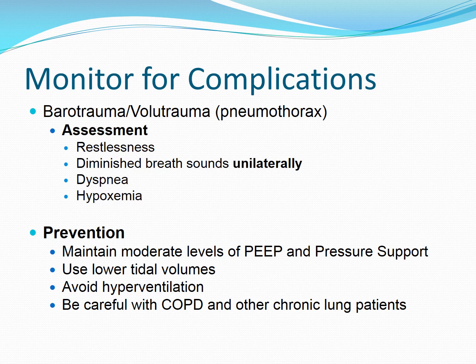So we don't want to have that PEEP at 15 or 18 if we can help it, because again, the higher the PEEP, the more we're expanding those alveoli and the greater chance we have for that baro or volume trauma. Also, that's why we're starting to use lower tidal volumes now instead of larger tidal volumes. We used to always have tidal volumes at 700-800, and so now they're a lot lower than that.